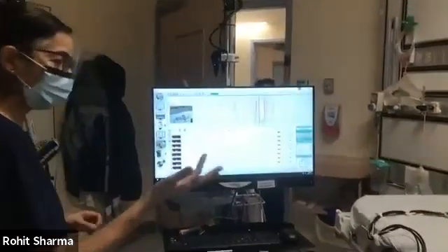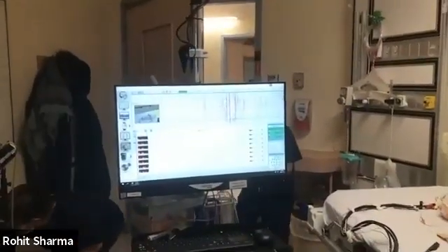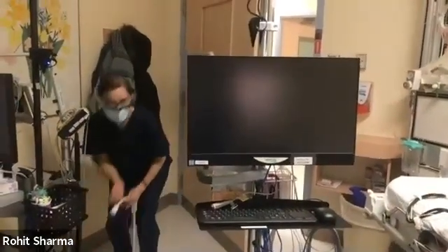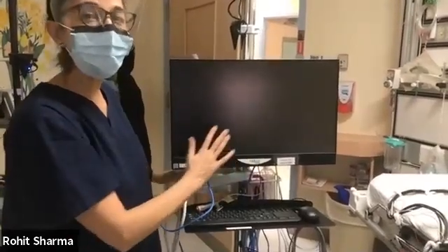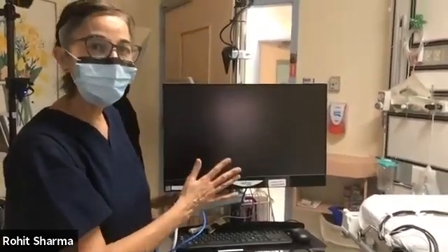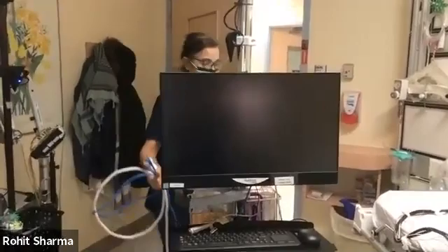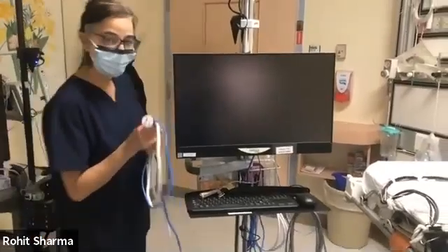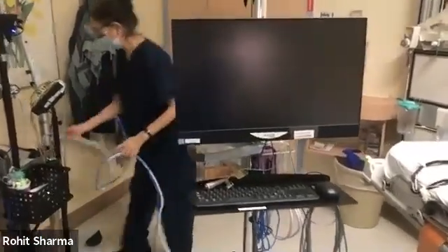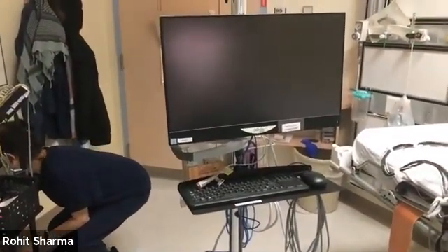The other thing I wanted to show you, I know we've described it in the CEG tip sheet, is that you can actually just pull the power cable out and pull the internet cable out, and you'll notice that the machine has been turned off. This is one way to move the patient to another room. If you're transferring from bed spot to bed spot, that would be good. You can do that too. So when you finish transferring the patient, you can actually just come back and we'll plug it back in again and have a look how that goes. So just make sure you always plug it into a red power plug.